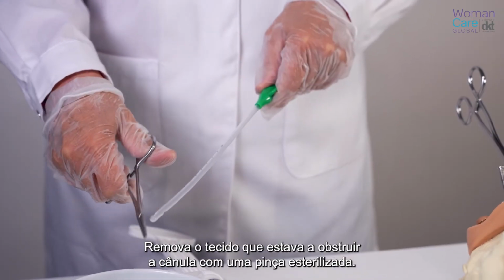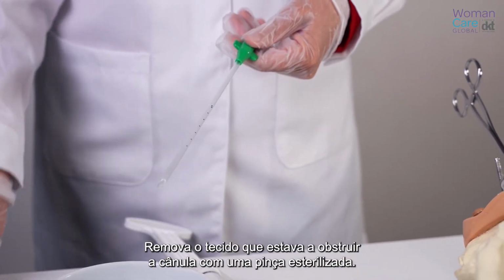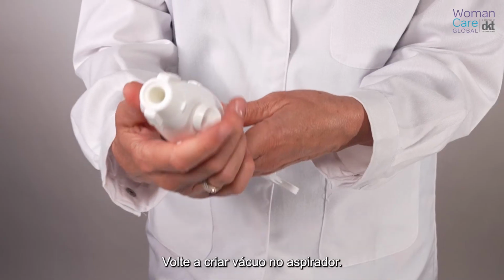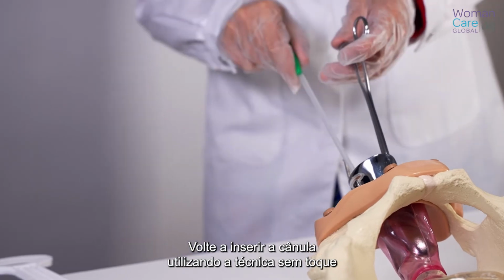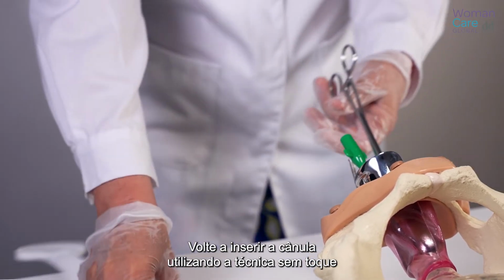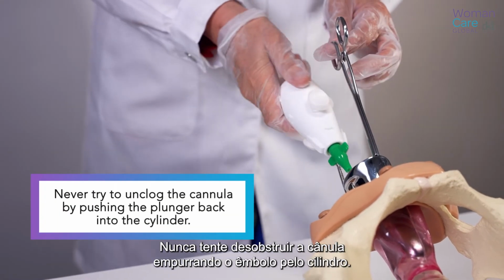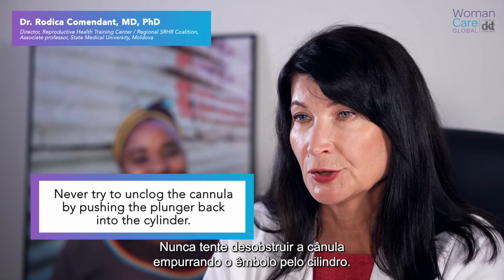Remove the tissue which was clogging the cannula with sterile forceps. Re-establish vacuum in the aspirator. Reinsert the cannula using the no-touch technique and continue the procedure if required. Never try to unclog the cannula by pushing the plunger back into the cylinder.